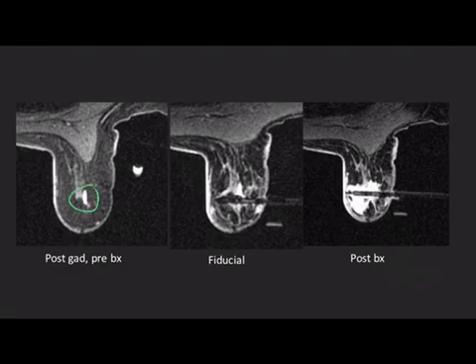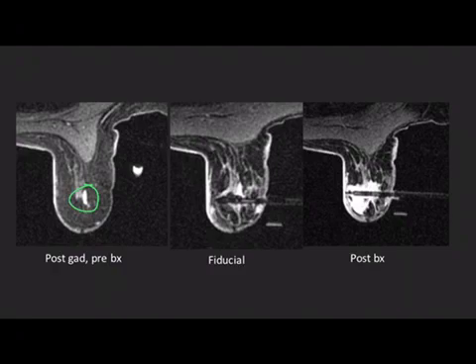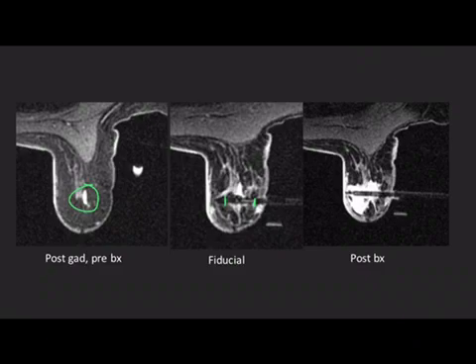Here's our lesion after gadolinium but pre-biopsy. This particular fiducial marker is different than the one I showed earlier. This one has gadolinium showing the entire chamber, showing that the lesion is in great positioning. Then post-biopsy, we have a nice hematoma there to show us we've done an adequate biopsy.